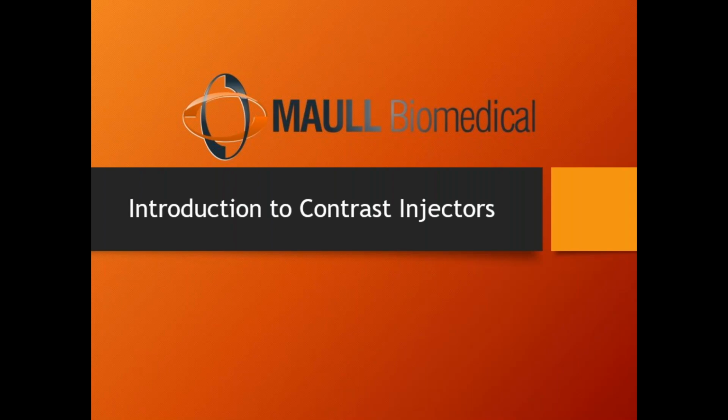So that plate is underneath the patient. If all the X-rays coming out of the X-ray tube were absorbed by the patient, that means no X-rays actually hit the plate and we just get a white image. If all the X-rays pass through the patient and strike the plate, then the entire plate is now black. So we need to have both penetration and absorption by the patient.